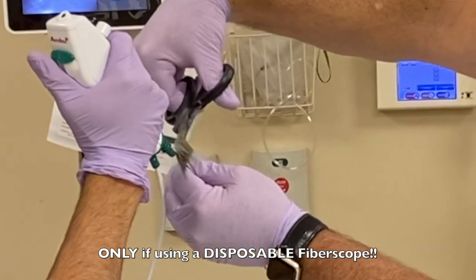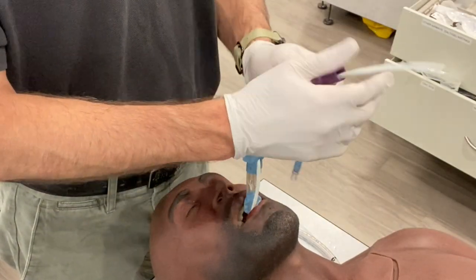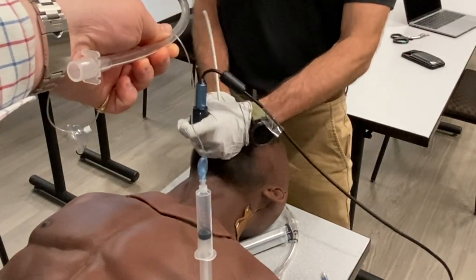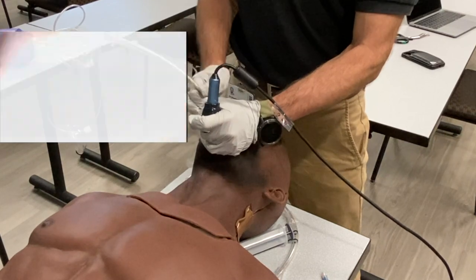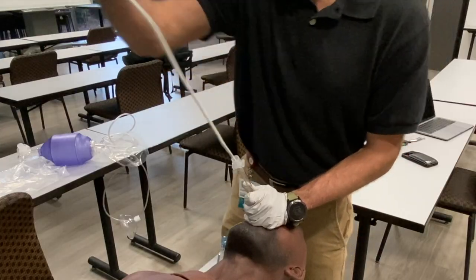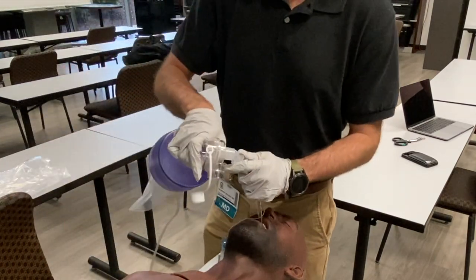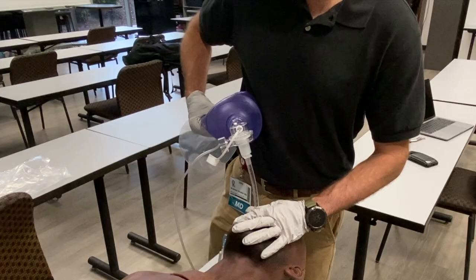Disconnect the fiberscope from the monitor and then, using trauma shears, cut the scope. Deflate the King Airway with suction immediately available in case of regurgitation. Then, either with the assistance of a laryngoscope or blindly, pass an endotracheal tube over the fiberoptic and watch it pass between the cords. With this technique, you can quickly establish oxygenation and ventilation in some of the most challenging airways and then, once resuscitated, change over to a more long-term endotracheal tube for ICU management.